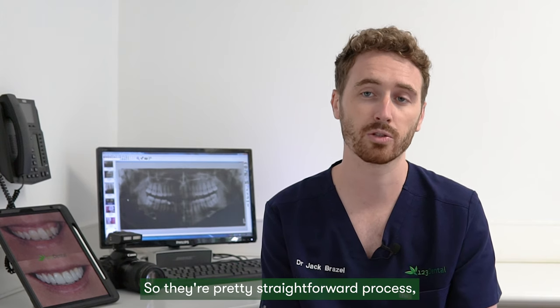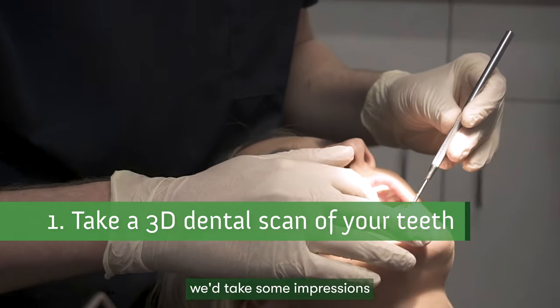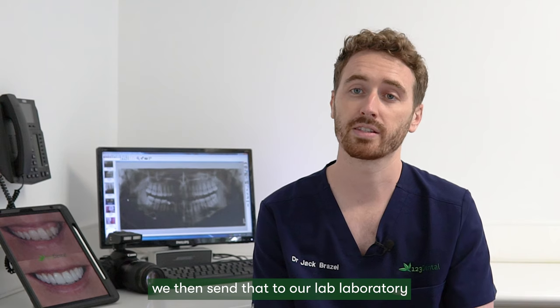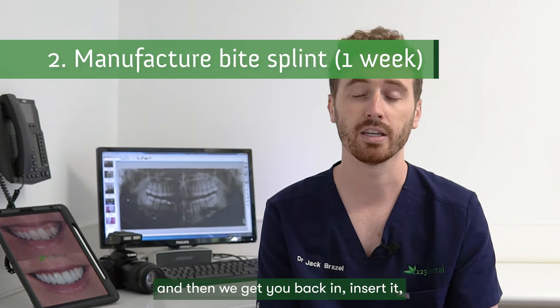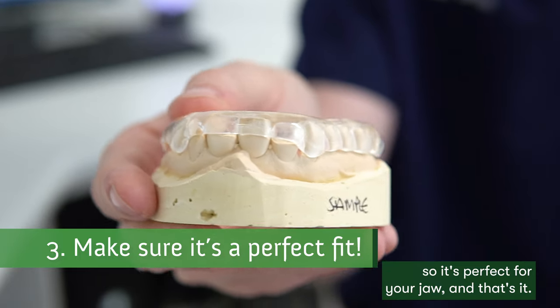It's a pretty straightforward process. At the first appointment we would examine your teeth and take some impressions or a 3D scan of your teeth. We'd then send that to our laboratory and they would manufacture it, which takes about a week. Then we'd get you back in, insert it, make sure it fits okay and is comfortable, and adjust the bite so it's perfect for your jaw.